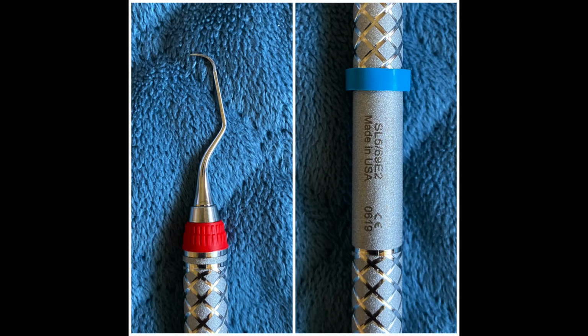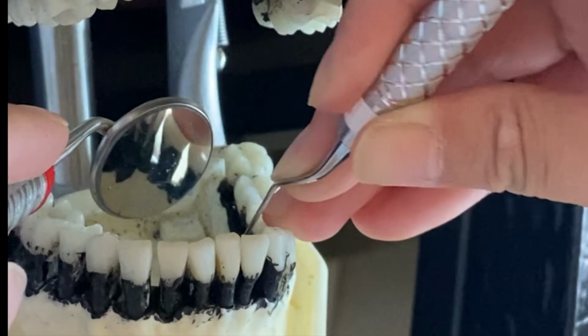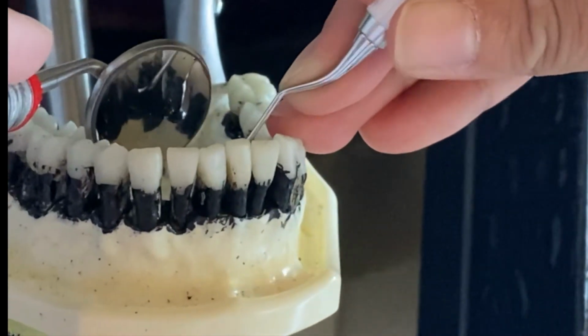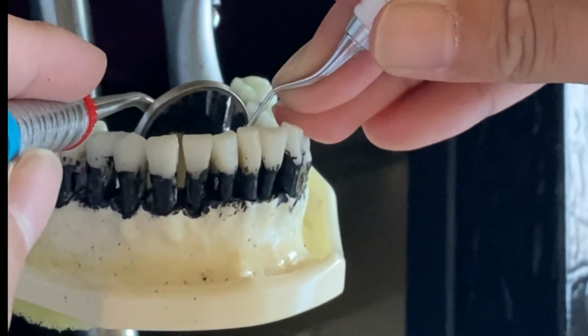Next, I'll be using the Langer 5-6, and I'll be using it on the lingual surfaces of the mandibular and maxillary anteriors. We'll be debriding going surfaces towards and surfaces away. Again, we'll be working with the surfaces away and surfaces towards, similar to when we were exploring, starting at that midline, going towards the mesial or distal surfaces. I'll also be sitting in the same chair positions as earlier.